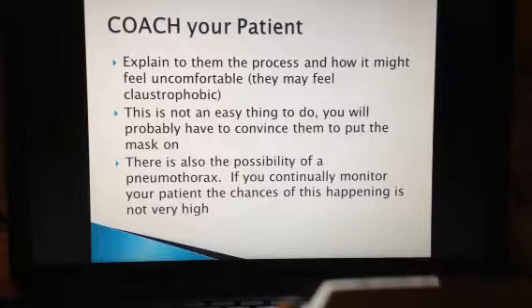It's not easy to do. Like I said, you'll have to convince them to put it on. There's also the possibility of a pneumothorax. This is a really small chance, but if you continue to monitor your patient, you should be fine.